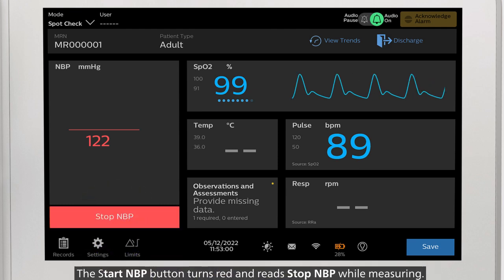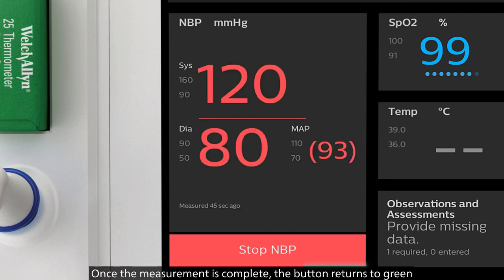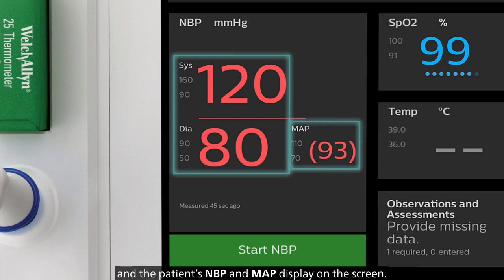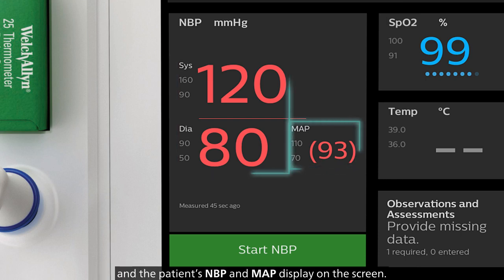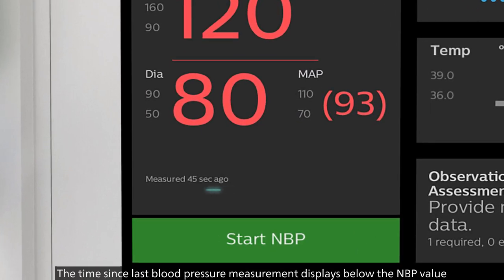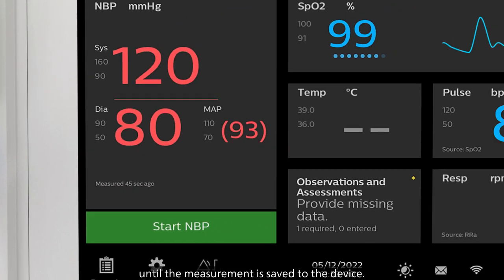The Start NBP button turns red and reads Stop NBP while measuring. Once the measurement is complete, the button returns to green and the patient's NBP and MAP display on the screen. The time since last blood pressure measurement displays below the NBP value until the measurement is saved to the device.